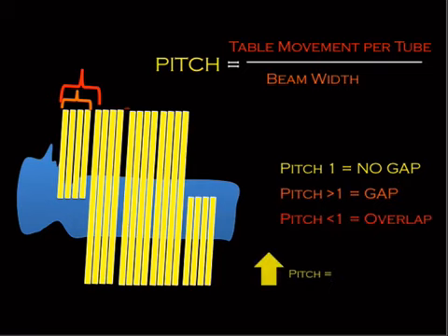Now, if you've got overlap, you've got more dose. And if you have a bigger space, then you have less dose. So there's going to be a dose element. If you overlap more, you've got the potential for improved spatial resolution. If you have a bigger gap, you have less spatial resolution.